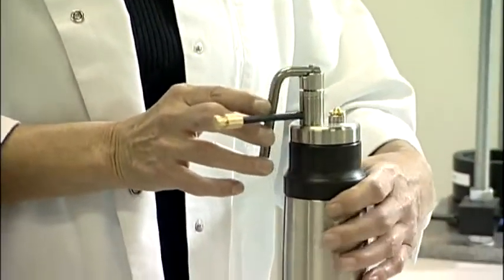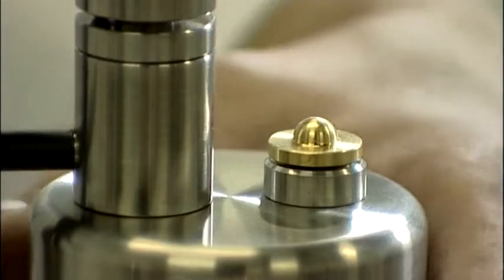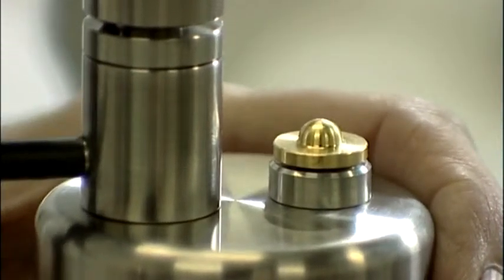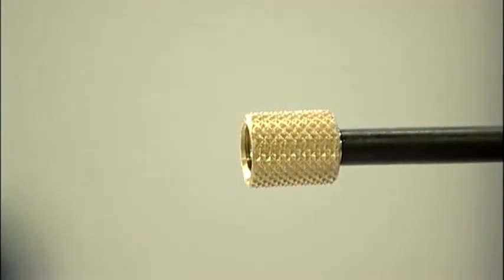Further, a pressure controlling relief valve maintains a constant operating pressure. This feature may be associated with a weak hissing sound, which is normal. A spray tube features quick attachment of different spray apertures and contact probes.